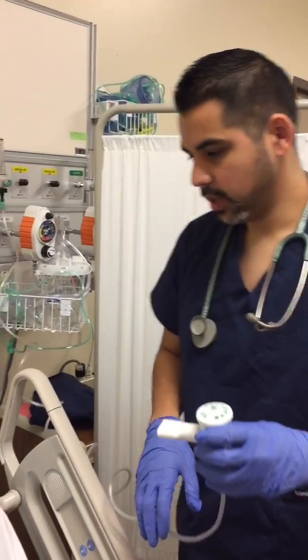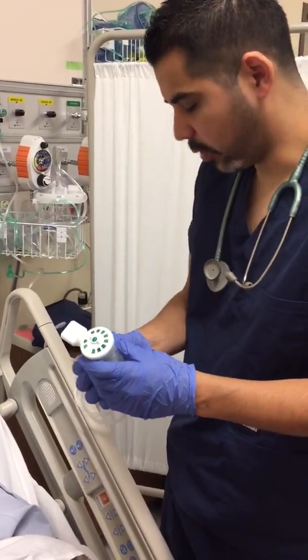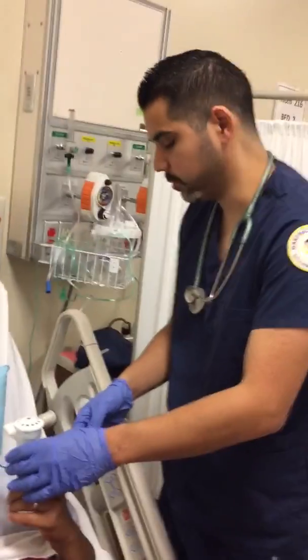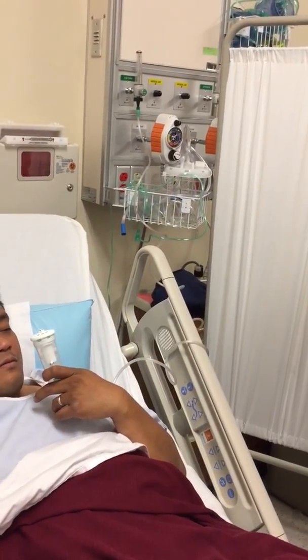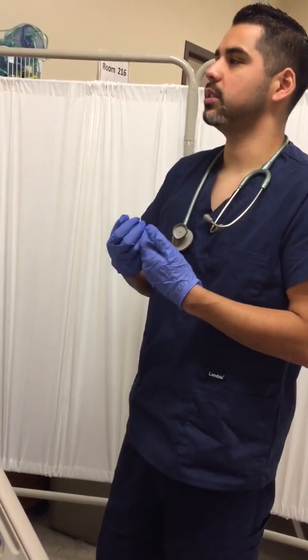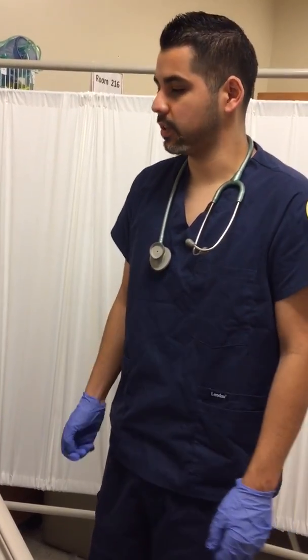Okay, Richard? This is going to take about 10 minutes, all right? So until the drug is all finished, just go ahead and wrap your lips around that. And then just breathe in slowly for me, slow and deep. Okay. And then Richard, after the 5th breath, I want you to take a nice deep breath in and hold it for about a couple seconds, and then breathe out through your nose, okay?